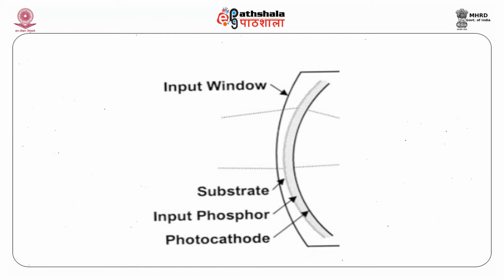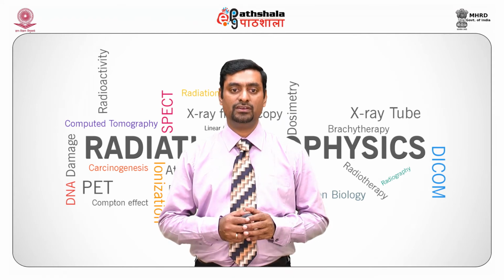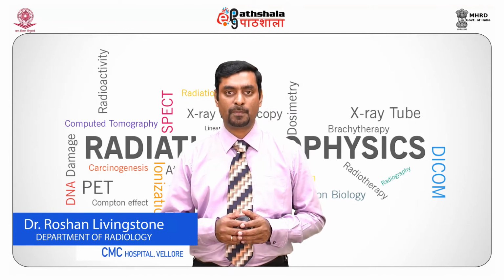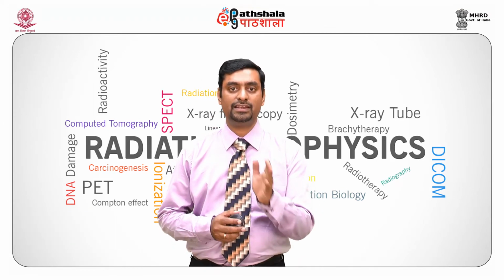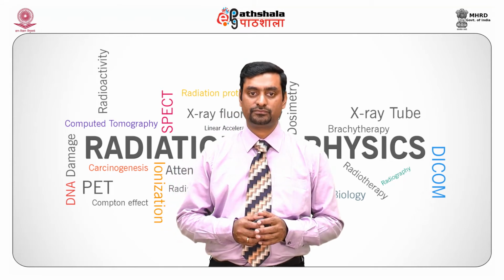The photocathode is a thin layer of antimony and an alkali metal. The function of this photocathode is to emit electrons when struck by visible light produced by the input phosphor. So when X-rays fall on the input phosphor, it gets converted into light, and the light gets converted into electrons with the use of a photocathode.